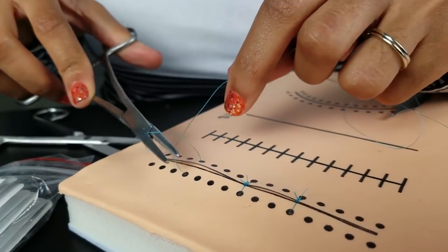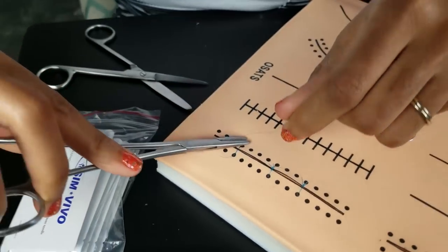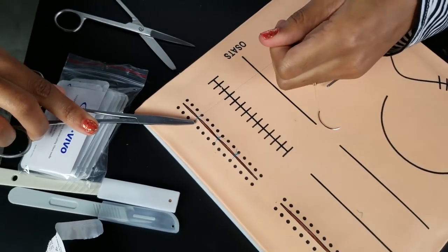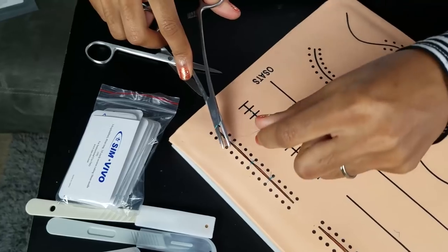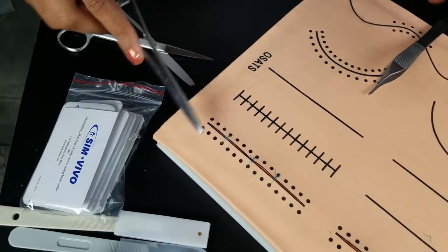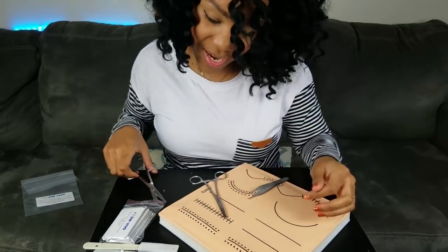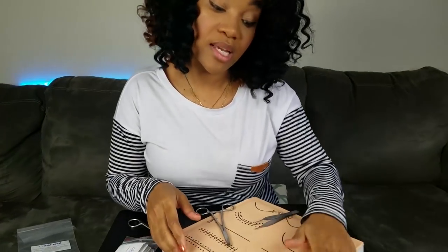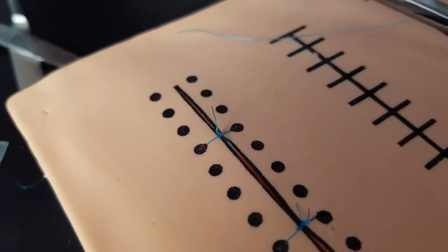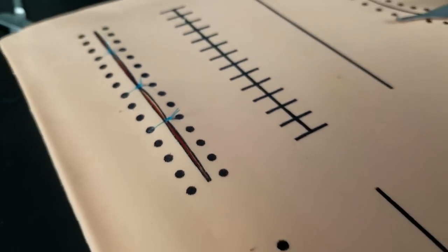Training with the nylon, because this is usually what you're gonna be using in surgery, is actually good. So you get kind of like the feel of this particular thread. And then you just are learning how to do these throws. Okay, so that one was a little light, but there it is. So I really like this. This is good. I'm gonna be spending a lot of time training on this because obviously the more that you train, the better that you're gonna become with doing these different suturing techniques.